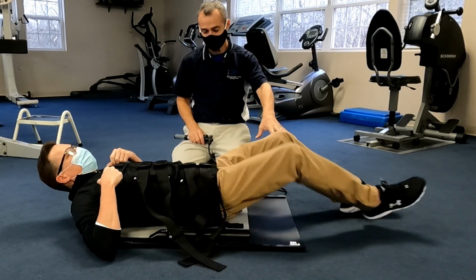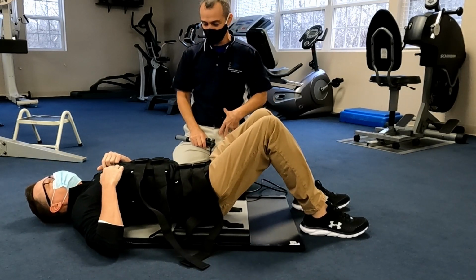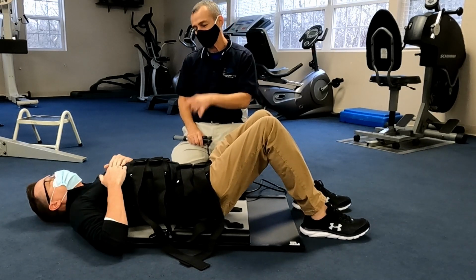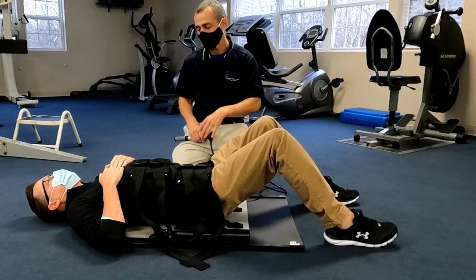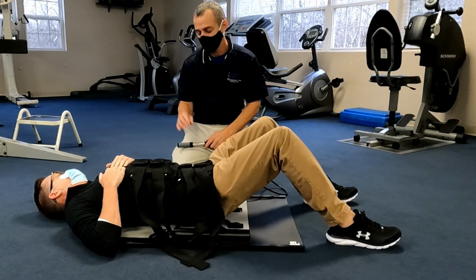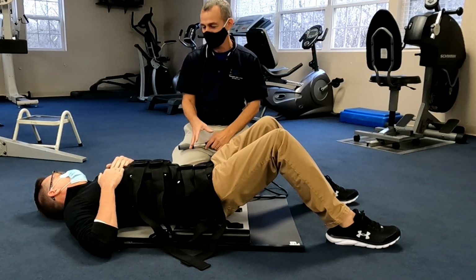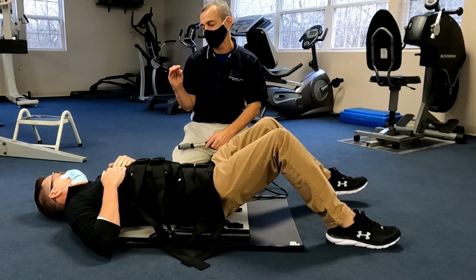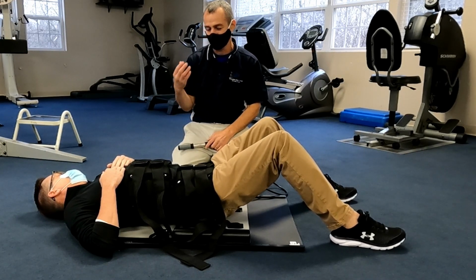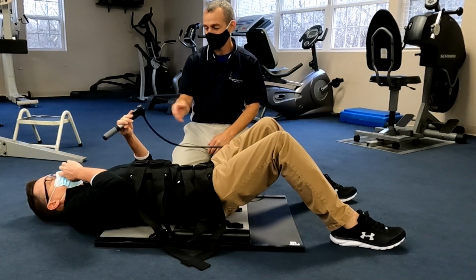Okay, so bend your knees, tilt your pelvis a little bit, wiggle your torso a little bit, get relatively comfortable. For some of my clients, I might put a little cushion, like a little folded towel, just because there is padding on the device, but not enough. A little bit of foam would be outstanding. Most people aren't going to have foam, so a folded up towel or something would give them that little bit of padding. Take that.